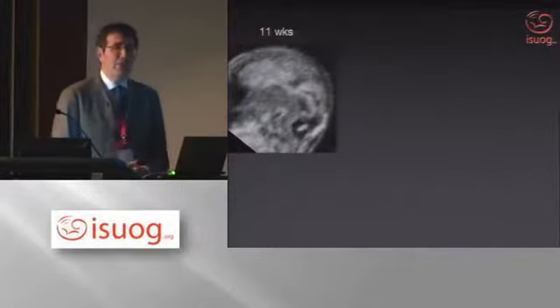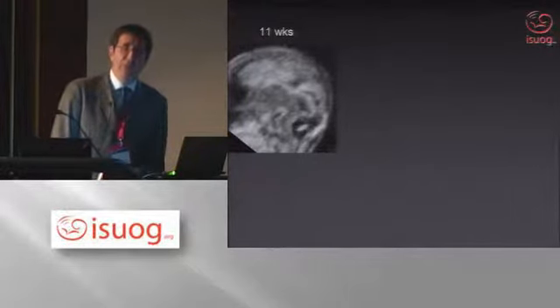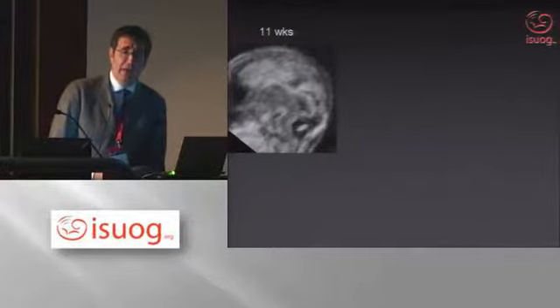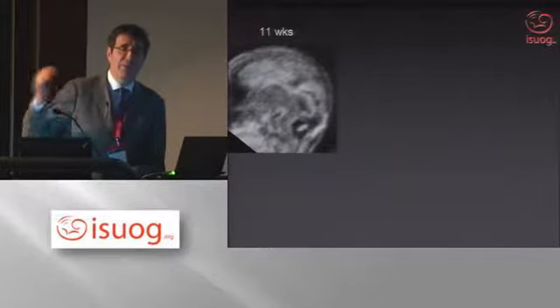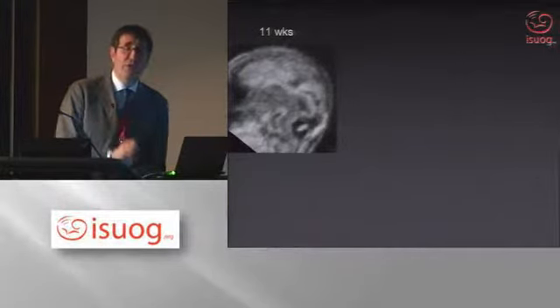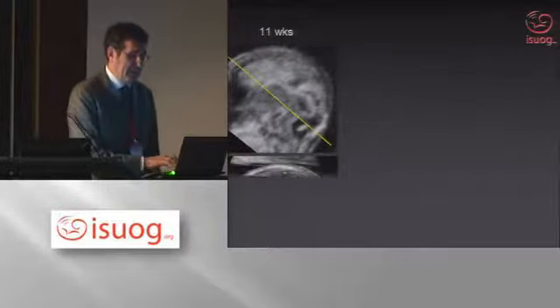Now, that is the normal appearance in a sagittal view of the posterior fossa at 11 weeks gestation, and the fourth ventricle is still a big cavity in that area. I would certainly recommend that you listen to Rabbi Chawi's presentation, because this anatomic landmark carries enormous importance for the screening of neural tube defects early in gestation.